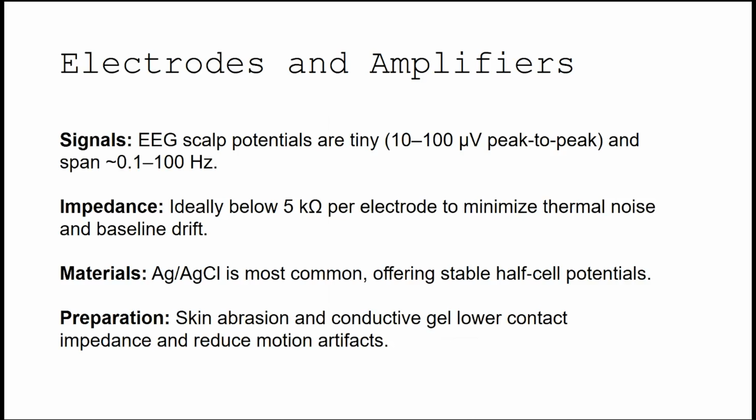Impedance is something we know if you liked to play with your electric pads in the past when you were a child. You know that impedance is something that is there if current is flowing, and the resistance a flowing current experiences is called impedance. To be exact, the impedance is the resistance you have when you place the electrode on the scalp. You have the fat, you have the skin, you have maybe sweat.